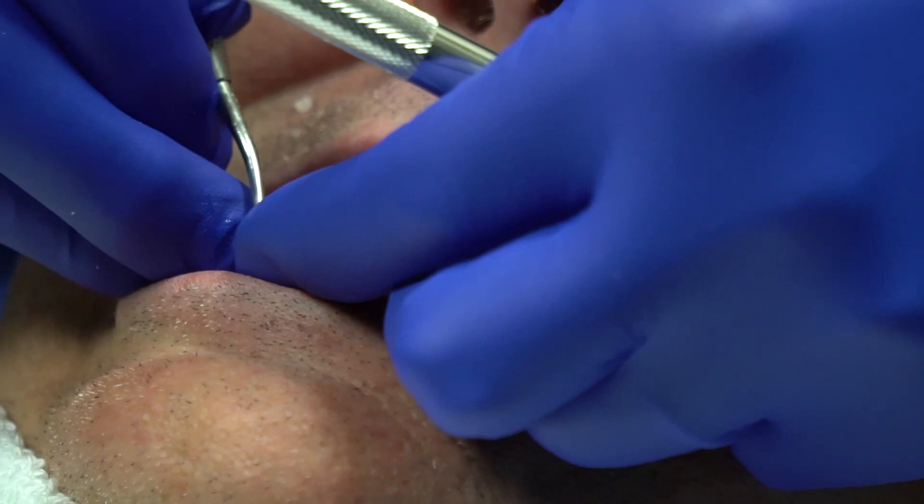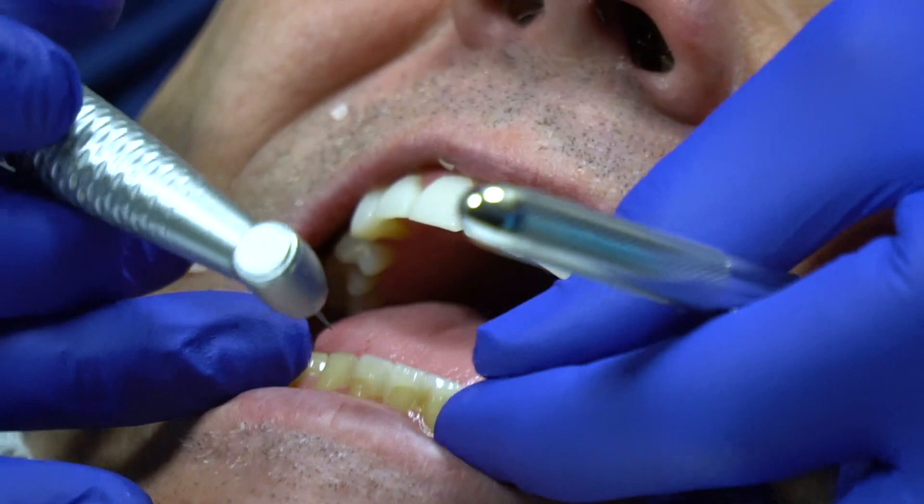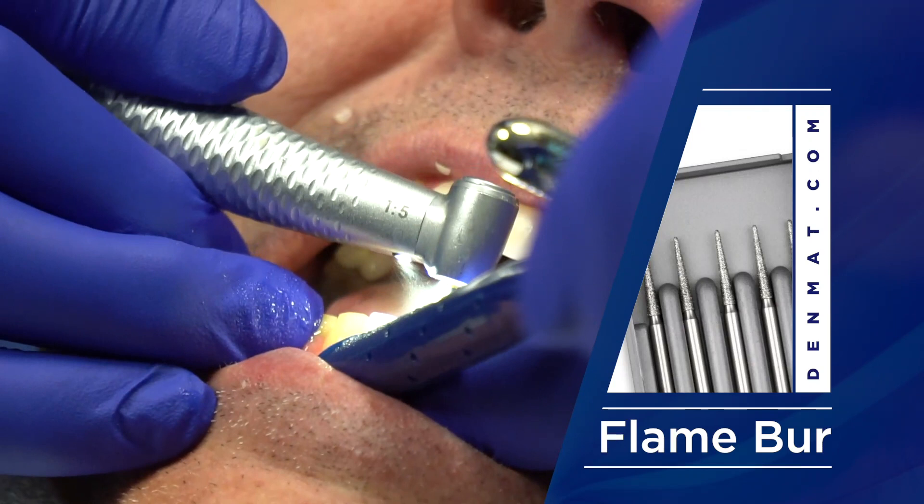Believe it or not, Randy's been wearing these temporaries for three weeks. This stuff doesn't want to come off, so I'm going to actually go in between the teeth and take a long fine diamond and go into those embrasures and try to individualize these temporaries.